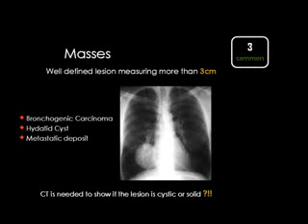But if the nodule is very rare, like let's say the rheumatoid nodule, and I have seen only one case of rheumatoid nodule in my clinical practice, and I don't consider the nodule seen on the internet or seen in the books. I mean the nodule seen during the regular clinical practice. Then pulmonary carcinoid, rheumatoid nodule, intrapulmonary lymph nodes, or all these nodules that are not frequently seen in clinical practice, so they are not included in my list of differential diagnosis. If you know a nodule, please.